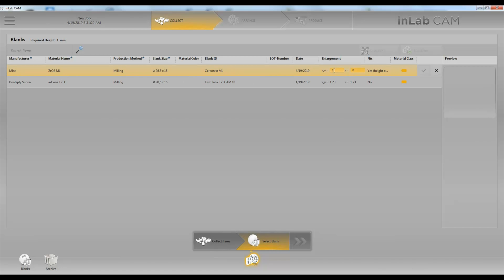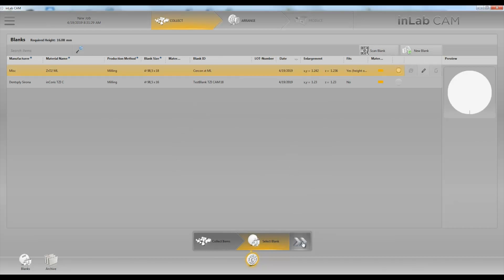Next we'll put in our enlargement factor. Check the box, then arrow forward.